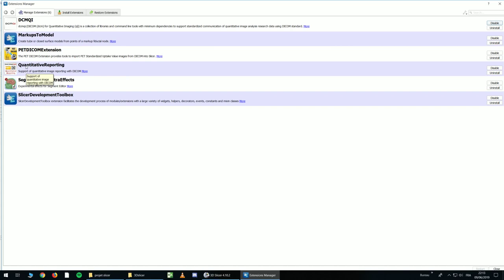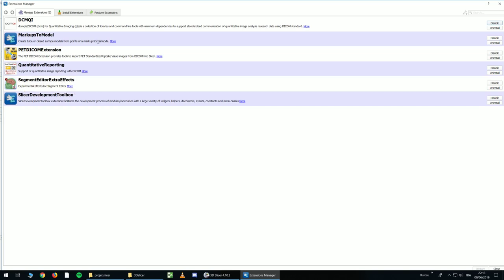First start with Quantitative Reporting, and then Segment Editor Extra Effects, and it will automatically install the other ones.